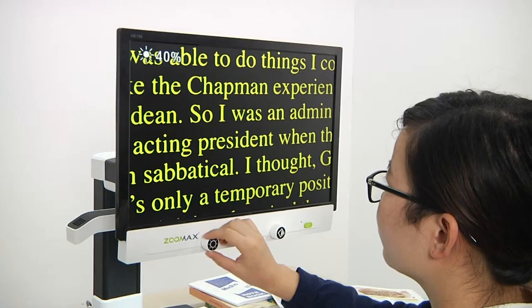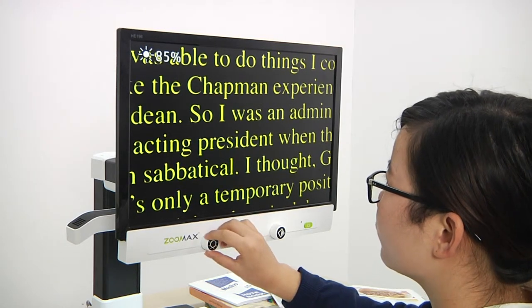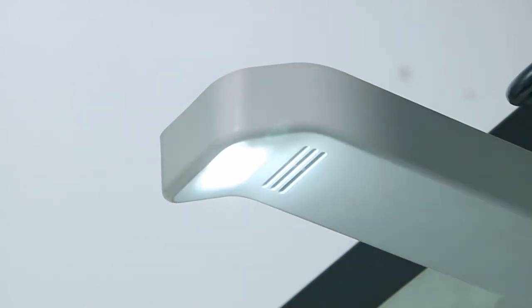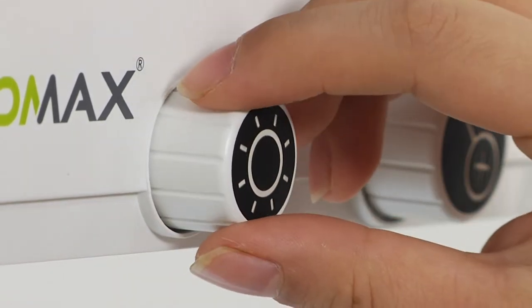Brightness dial: to get a perfect reading effect, you can change the screen brightness by turning the brightness dial. You can also adjust the brightness of the LED lights by long pressing the brightness dial for two seconds and then turning it left or right.